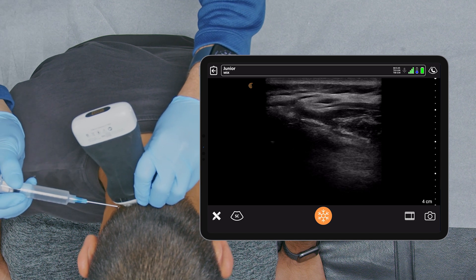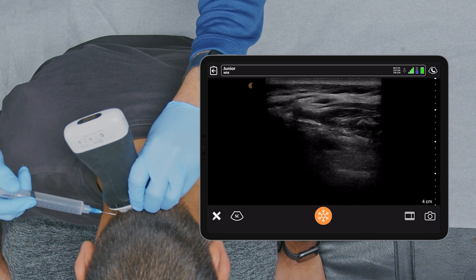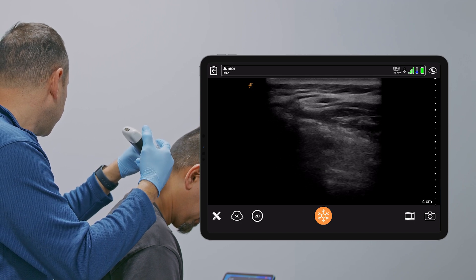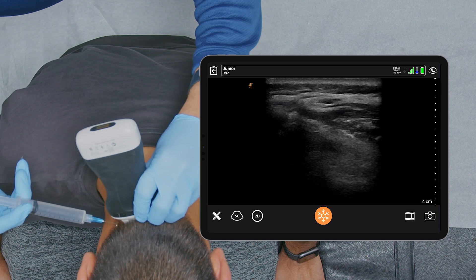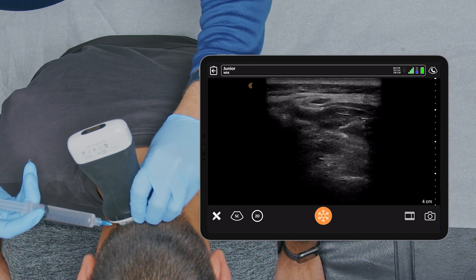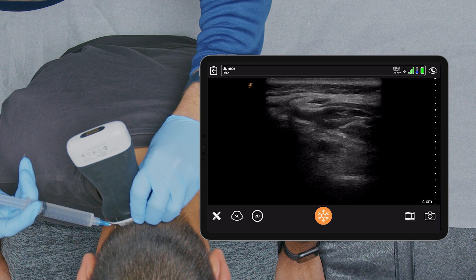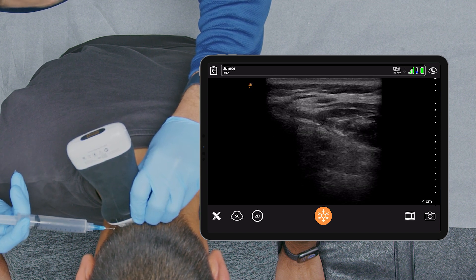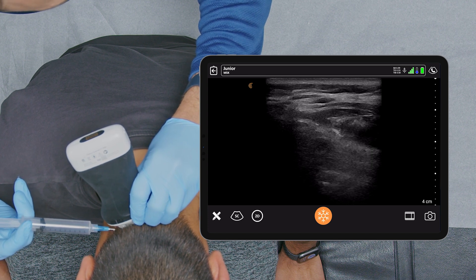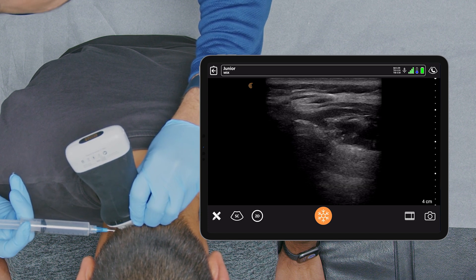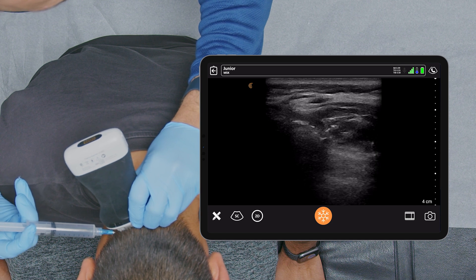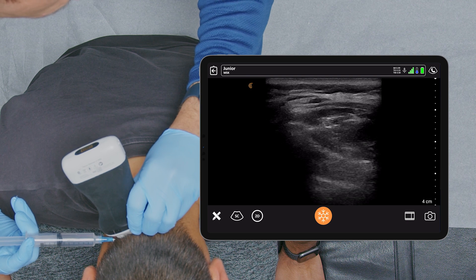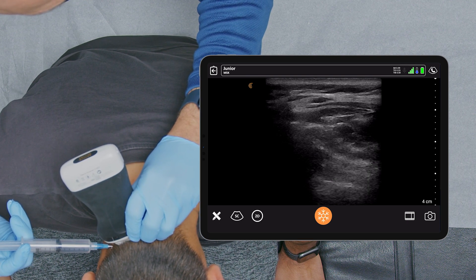You're going to feel a little pinch. I'm dissecting between the nerve muscles. Does it feel like I'm in the spot of your pain? Yeah, you are. It's crossing over between the muscle planes to get the nerve.